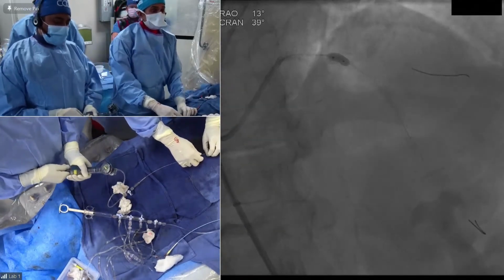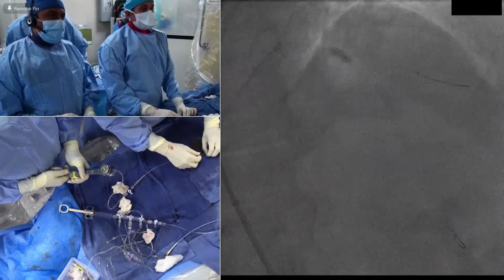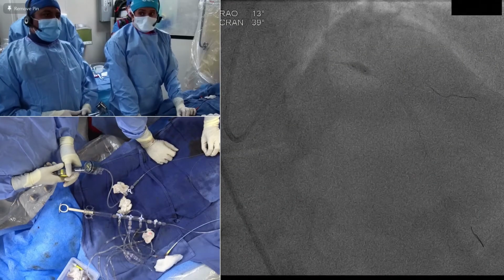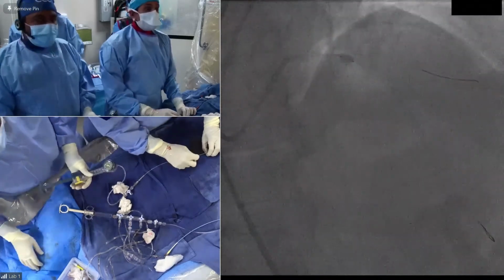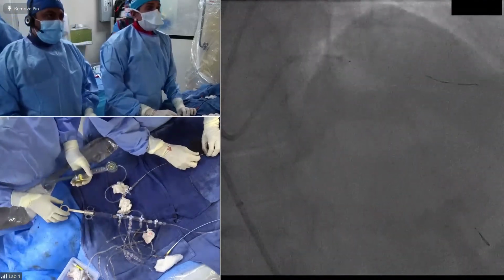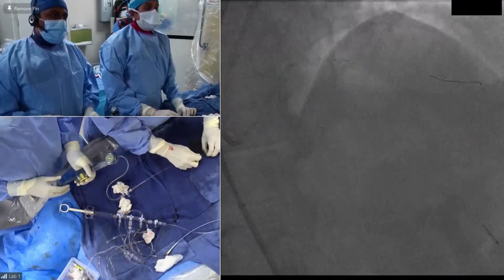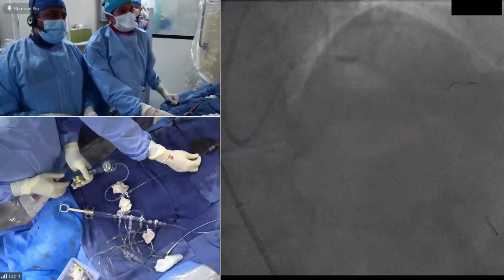Dr. Tierstein's idea: sometimes you have to keep the balloon up for 45 seconds in order to have the effect of the pressure. Okay, done. Okay, get the 2 stents. 45 seconds, okay. Well, in California, mini crush, New York technique, non-left main. Can we start playing the mini crush technique of non-left main by the side?